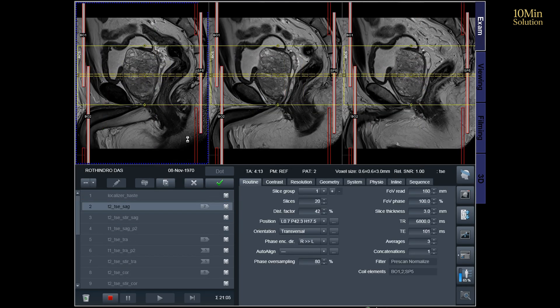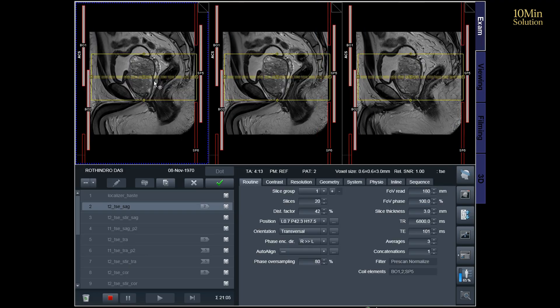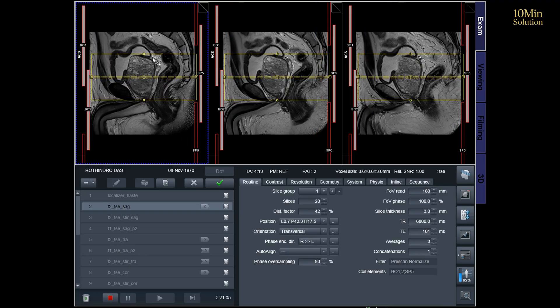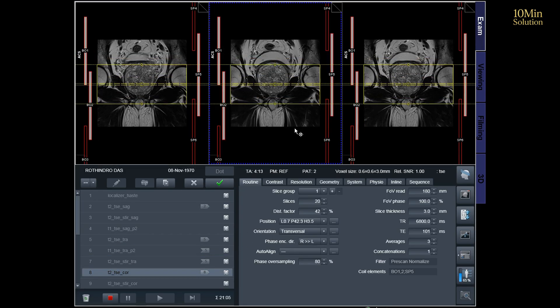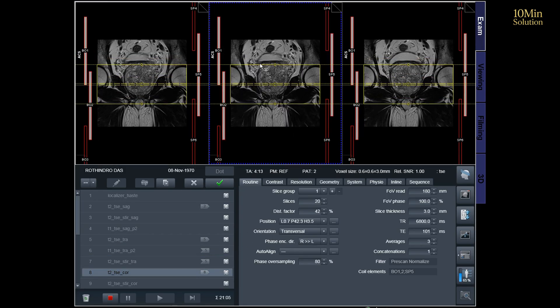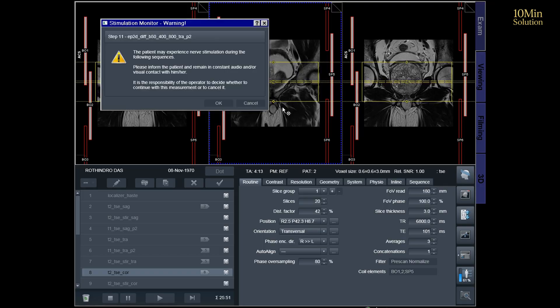T2C Axial Planning: Plan the axial slices on the sagittal plane. Angle the positioning block horizontally across the prostate, that is, parallel to the base of the penis. Check the positioning block in the other two planes. An appropriate angle must be given in the coronal plane, parallel to the right and left femoral heads.